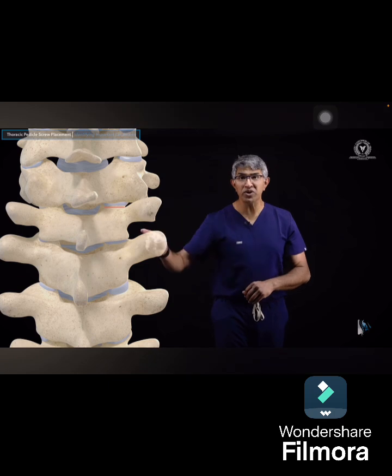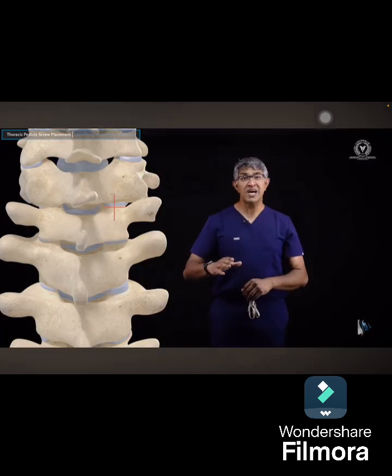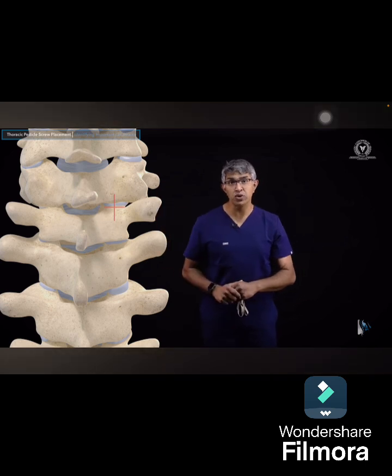Now, if you pick the midpoint of the joint, so that space right there, and divide it in half, so you're looking at the midpoint of it, it gives you this line over here. Some people use that as an indicator for where to start their pedicle screw, and I think that that is a very valid and important landmark to look at. But that's not the only position that you can place a pedicle screw.